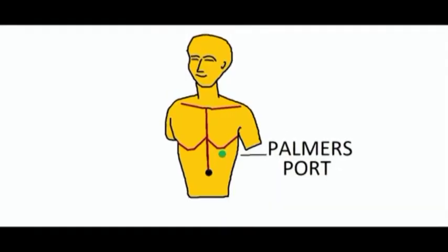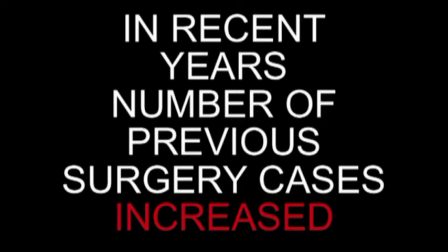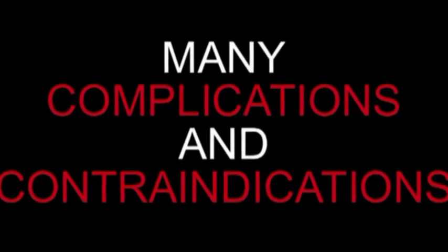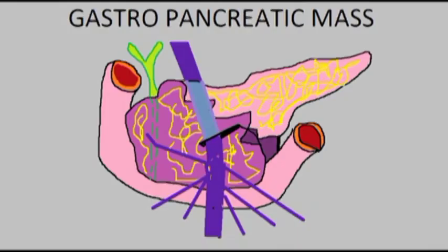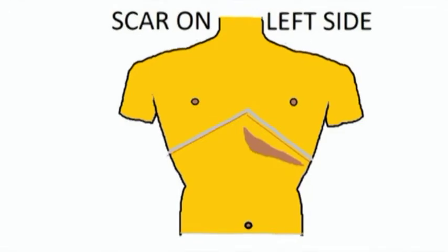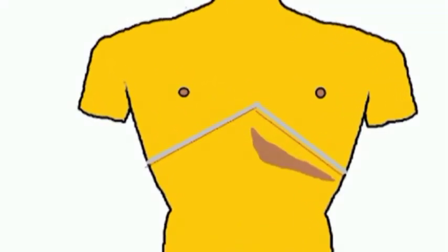Palmer port has enjoyed many years of use worldwide by all endoscopic surgeons, but in recent years, number of previous surgeries were increased and many complications of Palmer's point entry and many contraindications emerged. For example, hepatosplenomegaly, portal hypertension, gastropancreatic mass, huge gynecological masses, scar left side, as in cases of splenectomy or gastric surgery.